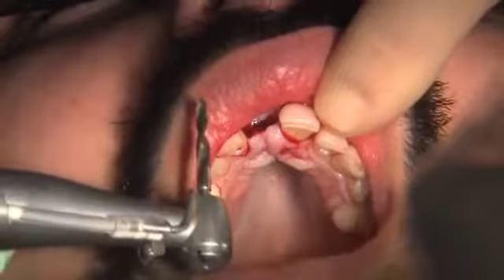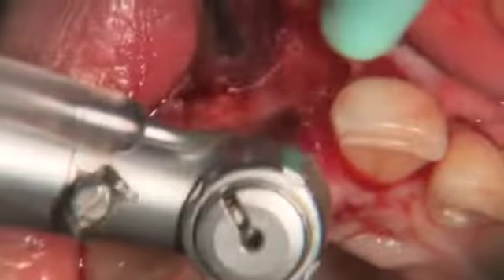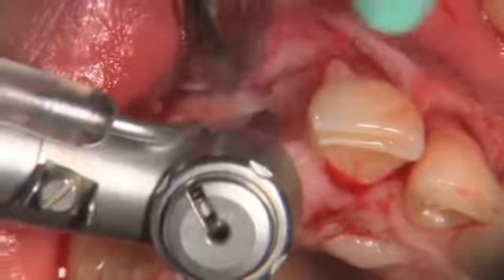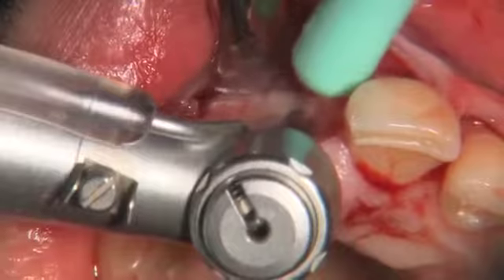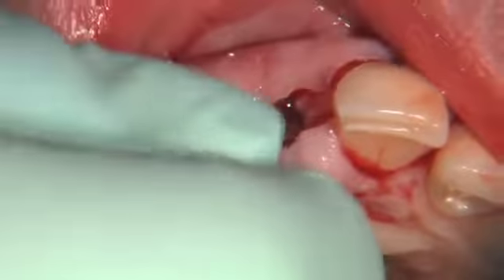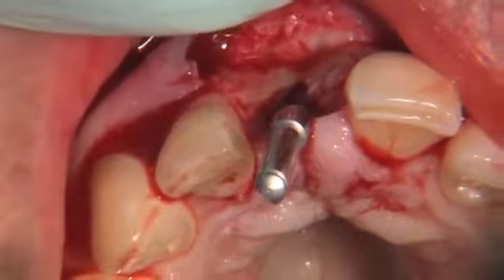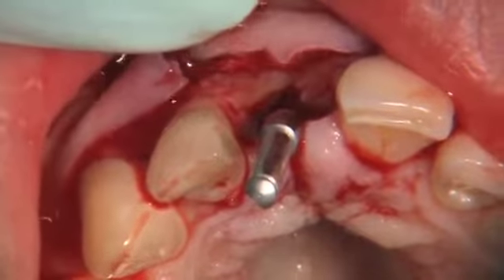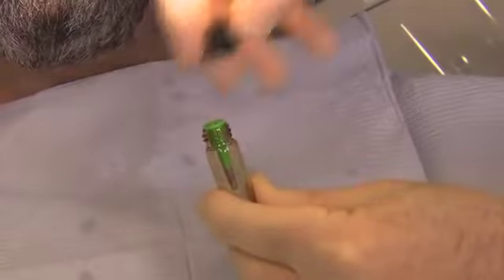And our final 2.8 millimeter drill is introduced here to complete the osteotomy. Uprighted slightly to correct for a slight angulation distortion that occurred during the initial osteotomy. The final drill is replaced into the osteotomy site and a periapical film taken to confirm the final length and orientation in relation to the adjacent teeth roots. Once this has been done, the implant is removed from the vial.